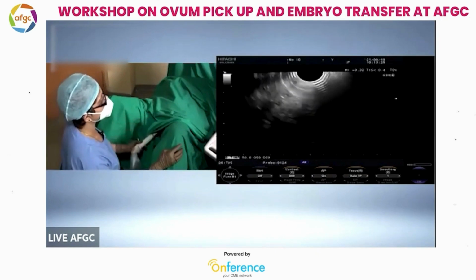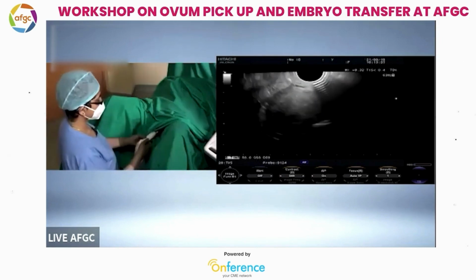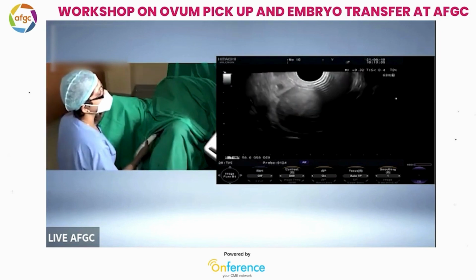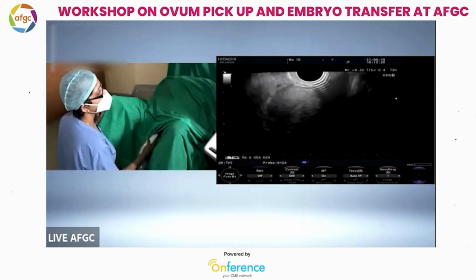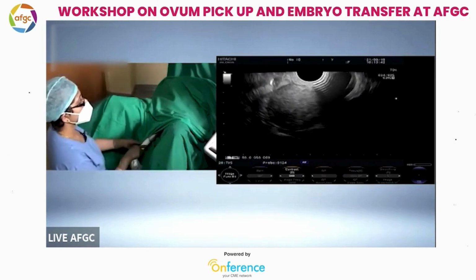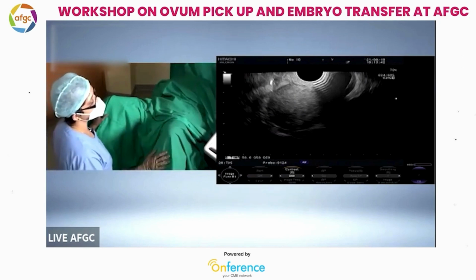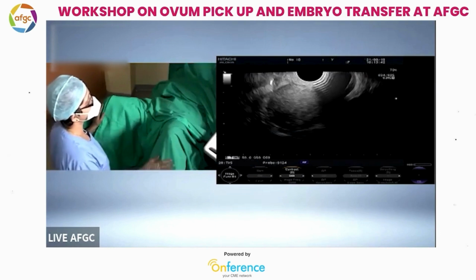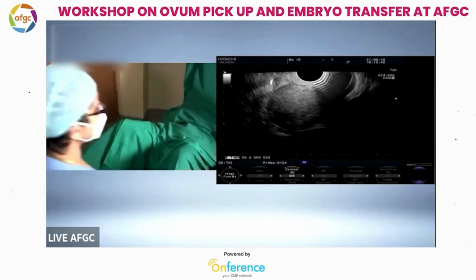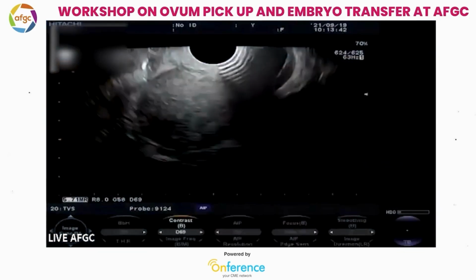Is she on any stimulation? No. Okay, now freeze this view. So in this we are going to discuss, can I have single view of the ultrasound while the patient can be changed? Single view of ultrasound? Yeah.